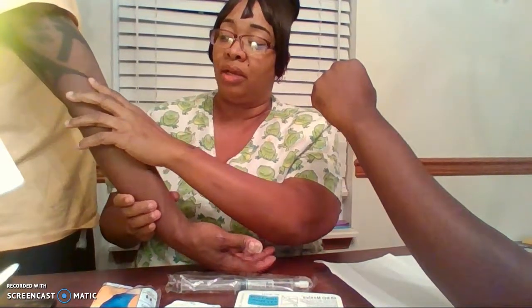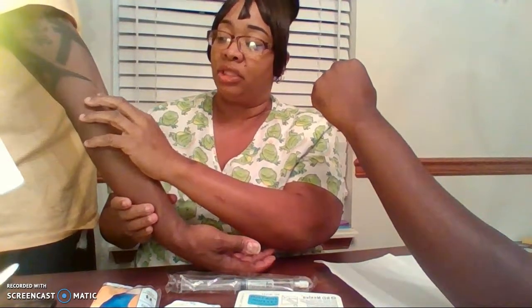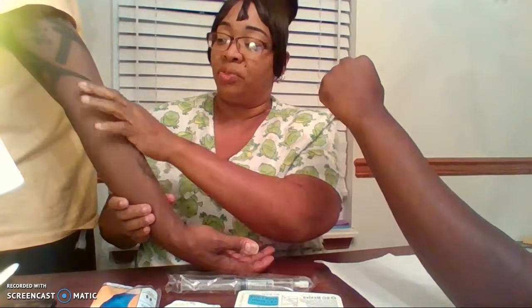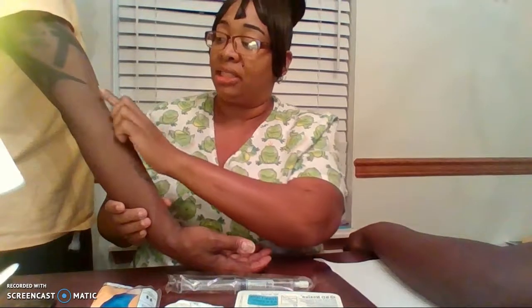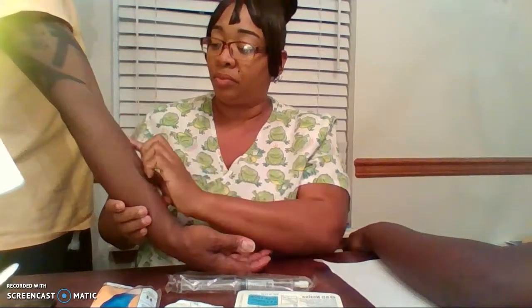And these are usually leaned towards more by emergency staff, like ambulance drivers and emergency room patients, but also cardiac patients that are getting cardiac surgeries have these larger gauge angiocaths in their body, and so you have to find a vein that'll be able to support this size gauge.